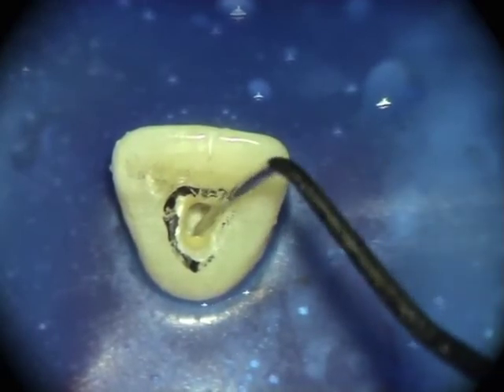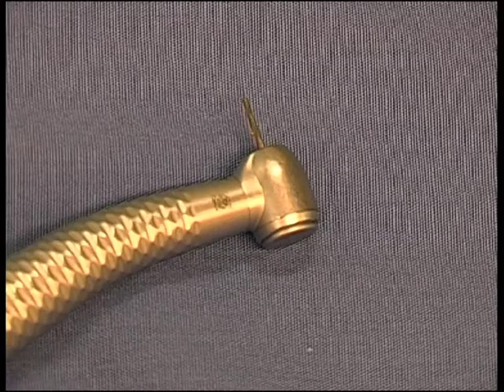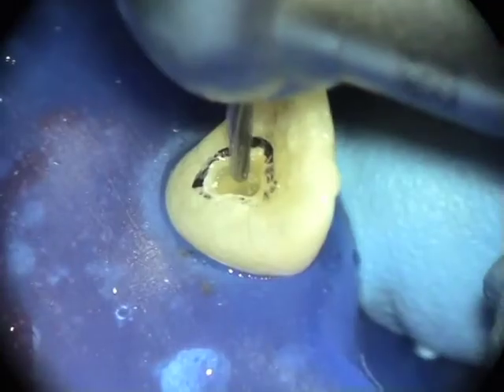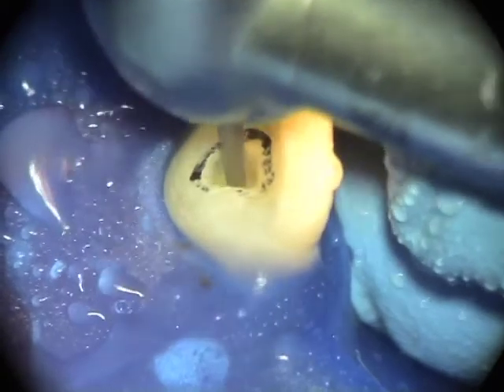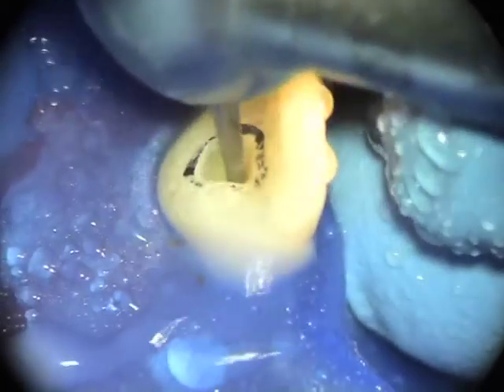Using an endodontic explorer, the root canal can be identified. A blunt-ended endo-Z burr is used to flare and finish the axial walls. The burr is moved laterally to smooth and shape the walls of the access cavity, again taking care not to enter the root canals.